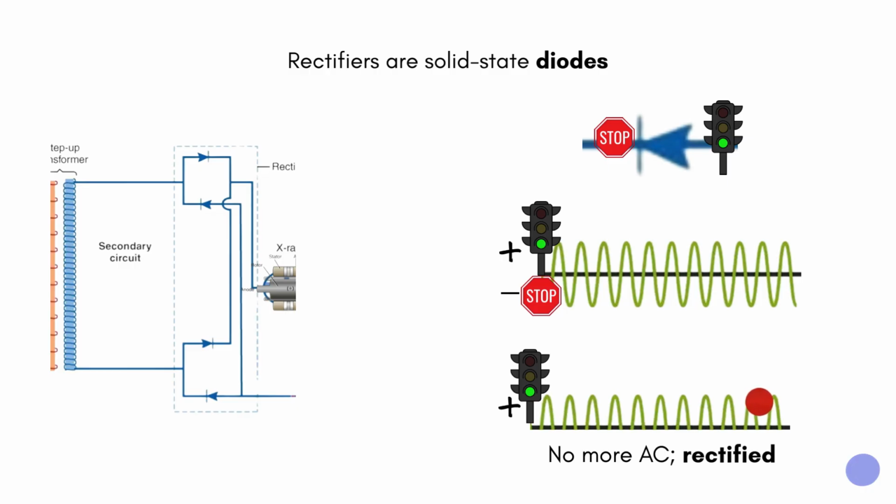So what these little rectifiers do is stop the battery, basically, right? The positives and negatives, think about it, stop them from flipping. And when it gets to that negative side here, every time it wants to switch over to this side, it stops it. But it still allows it up here on the positive side. So what the wave would end up looking like is nothing's happening down here. Everything is kept in the top.